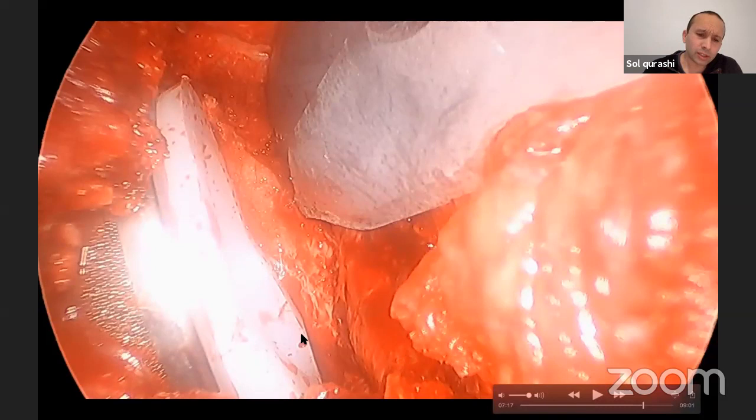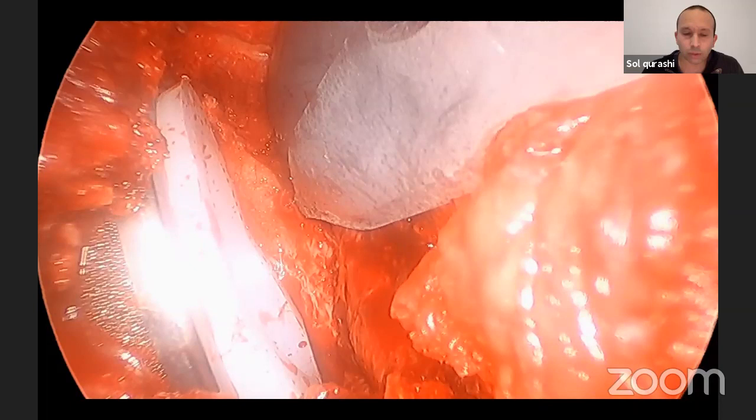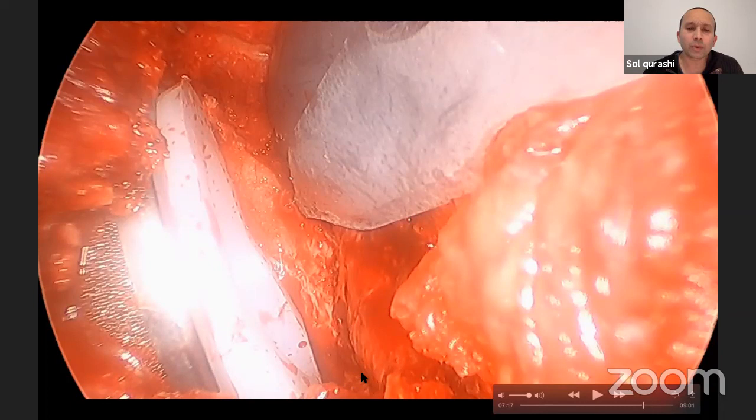Now you might notice it's a lip liner, and I actually don't need lips for stability, but the story is that one day the rep opened a lip liner by accident, and I didn't want to waste it. So I thought, well, if I put it inferiorly, normally there's a bit of bone shelf proud anyway, so I don't think it's going to cause me any impingement. And I did that, but it got me thinking.